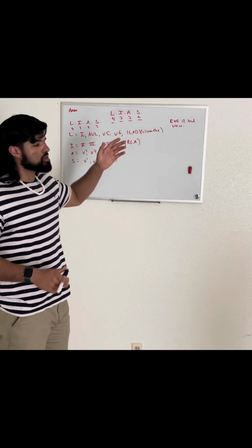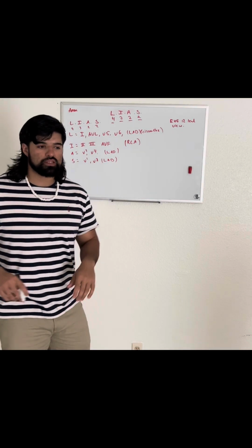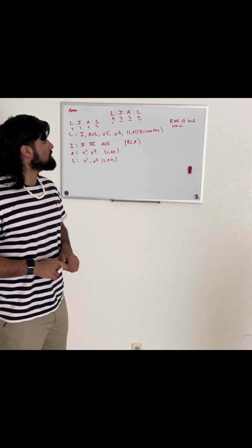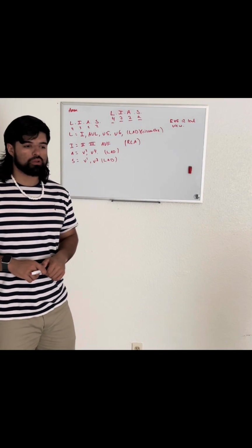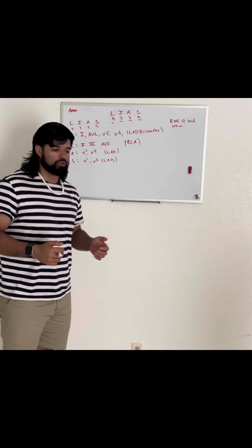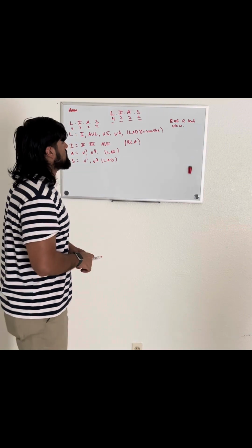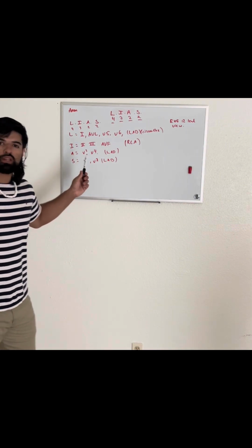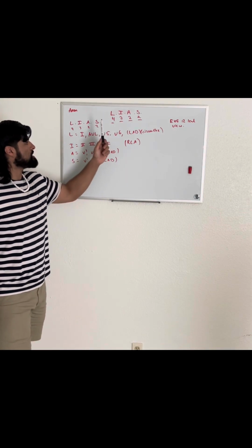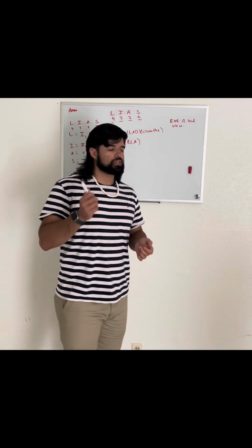So this is very important. I thought it was pretty cool to show you guys who are probably taking the CCT exam or the CRAT. I would say it's a cool mnemonic to remember, and I think it's going to help you a lot whenever you are ready for taking your board exam or your license or anything like that. So this is how you read a 12 lead EKG. Remember LIAS, L-I-A-S. Hopefully this mnemonic helps. I hope you guys enjoyed the video.